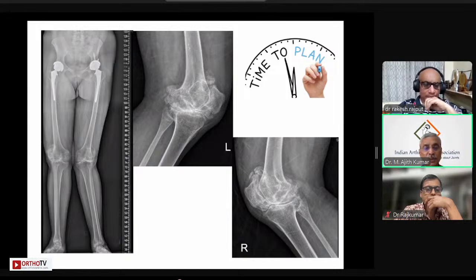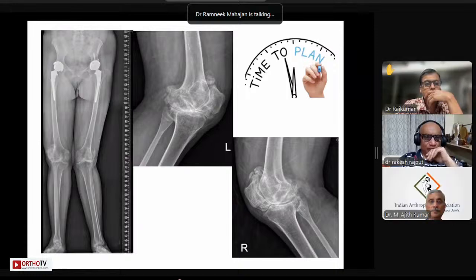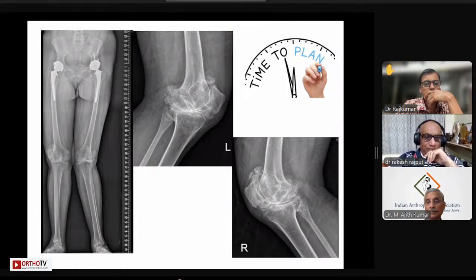Considering the osteoporosis, you need to be a little careful with your handling. It's a known rheumatoid also. So slowly keep working around, and as in hip, we say work around 360 degrees. Here you work all around the condyles, outside first, then inside. When you keep gently releasing all the adhesions, remove all the ACL, PCL, whatever you see there, I think you should be able to get some more working space.